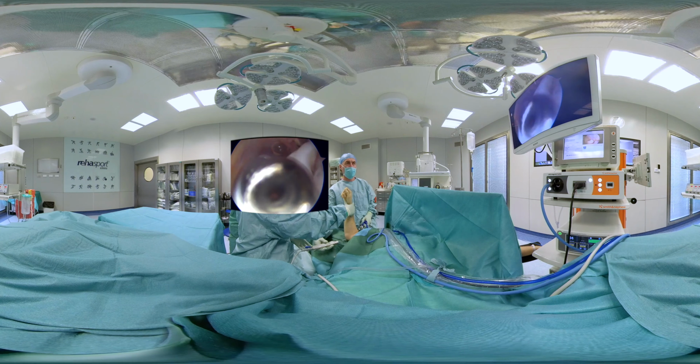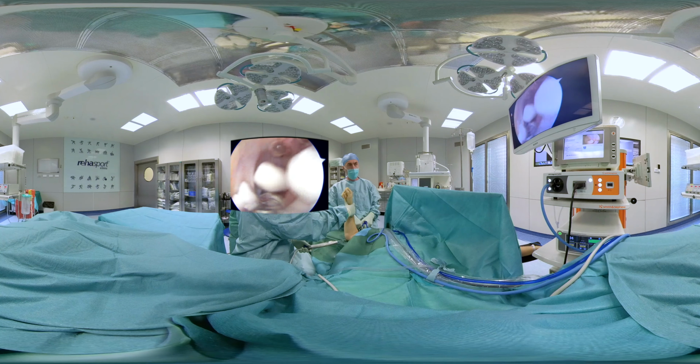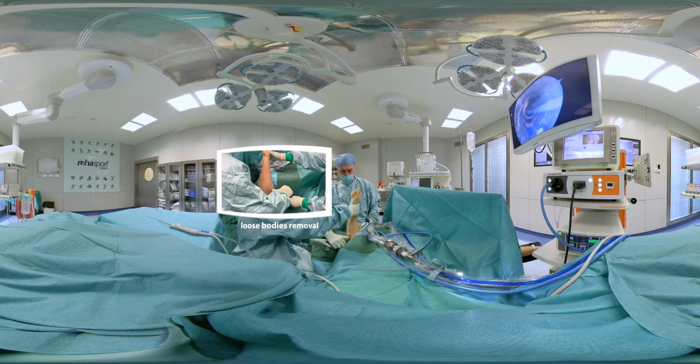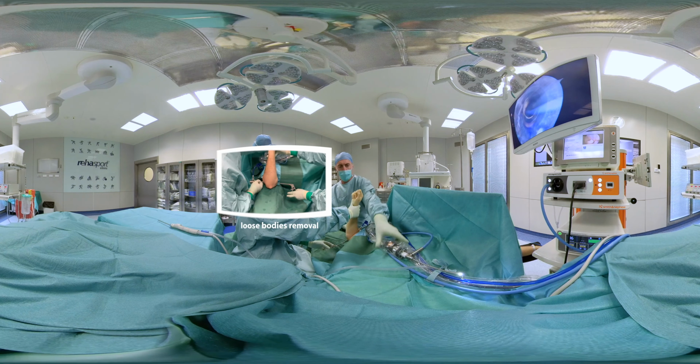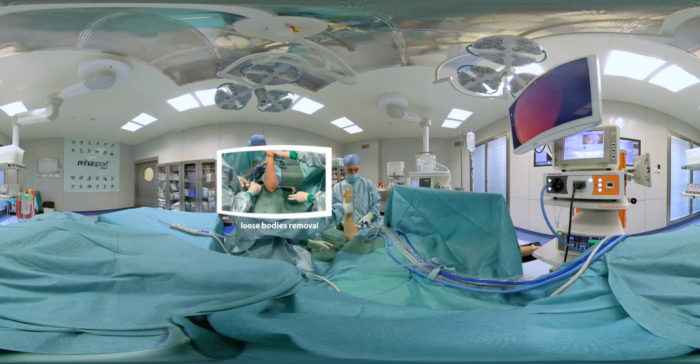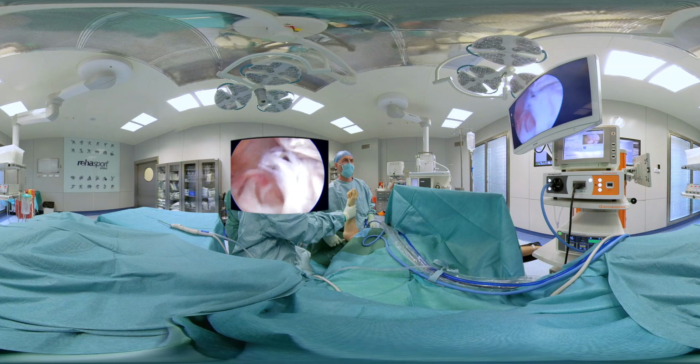After preliminary debridement of inflamed synovial tissue, loose bodies need to be removed with graspers. Larger loose bodies might need to be removed in pieces, or skin incision has to be enlarged for successful removal.